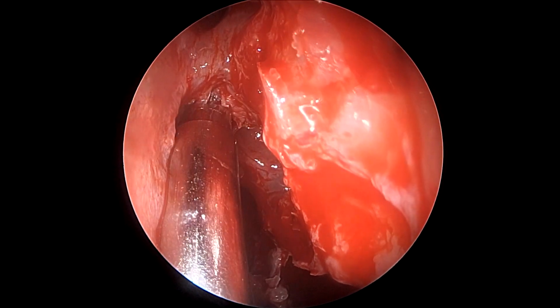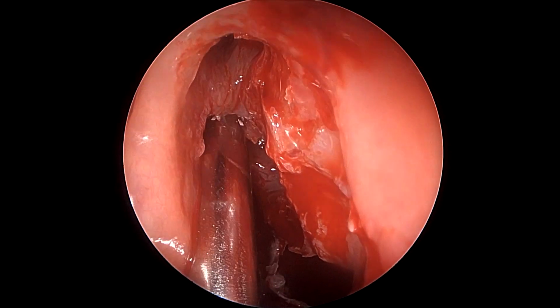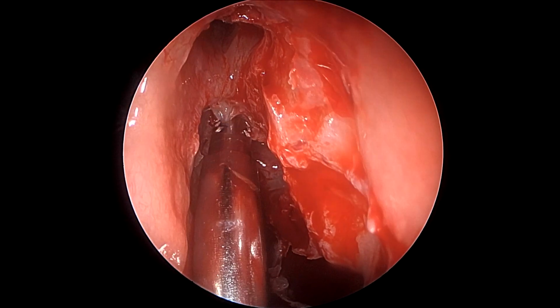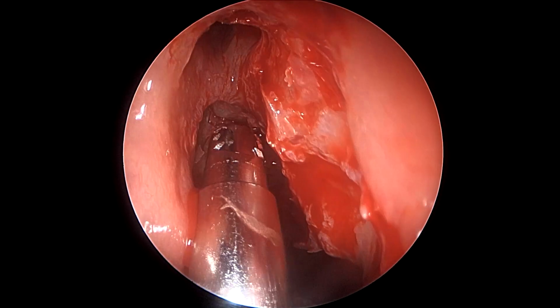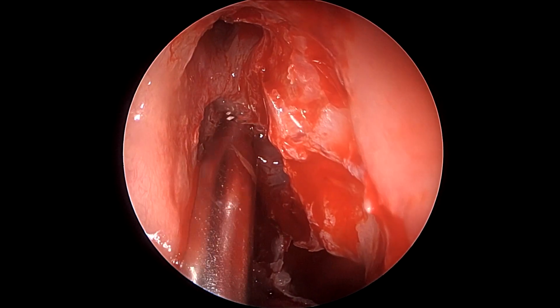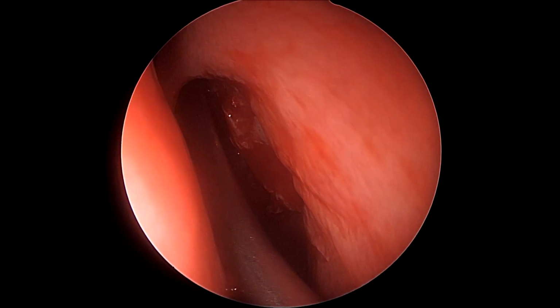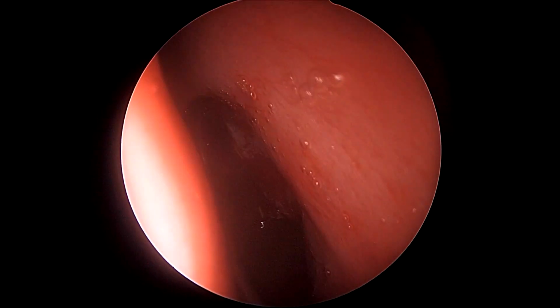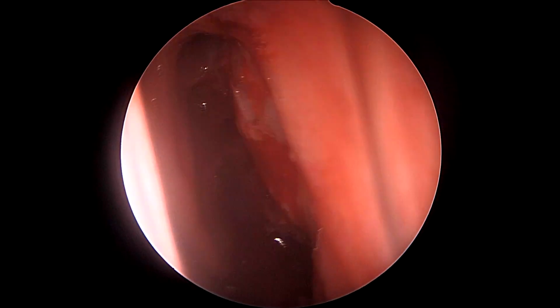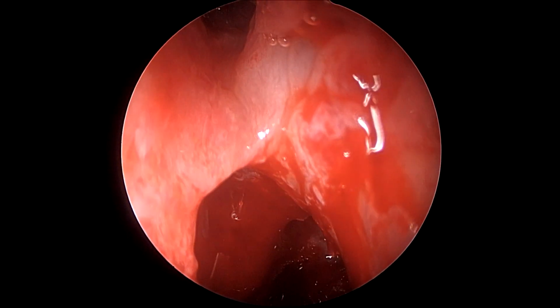The frontal recess has been opened, and as we see here, there's some edematous mucosa, but we would prefer not to scar it too much, or to use the debrider inside the sinus. The anterior ethmoidal complex behind the frontal sinus has been opened, and once it is freely irrigated, it seems to be a reasonable place to consider completing the surgery.